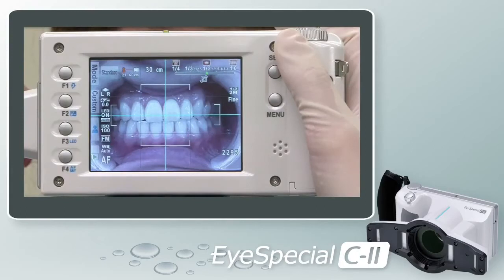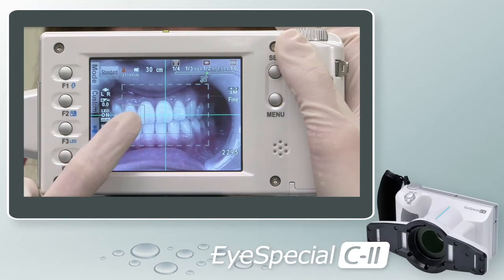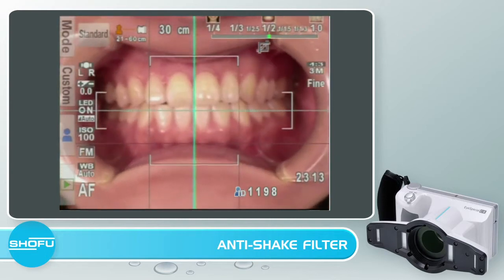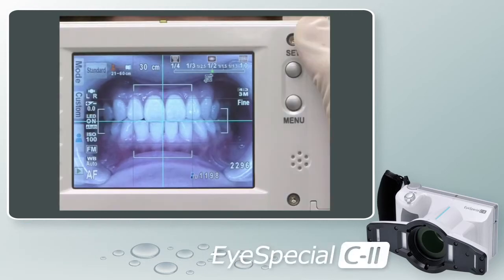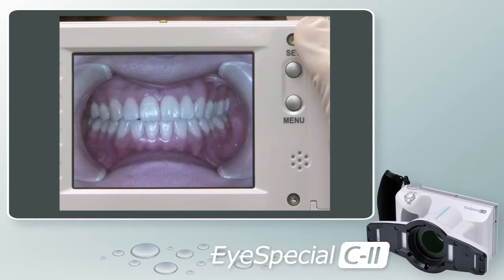Much like a smartphone, the iSpecial C2 comes equipped with the spot focus feature. To employ this feature, tap the screen — you will see a square box pop up. You can then tap the screen to move the box to the location you would like to focus. To remove this feature, simply press and hold the screen until you hear it click and the box disappears. Everything on the shooting screen has been optimized for dental photography. The iSpecial C2 has built-in infrared, UV, and anti-reflection filters, and most helpfully, an anti-shake filter — so even with a shaky hand, the camera will deliver clear and consistent images.